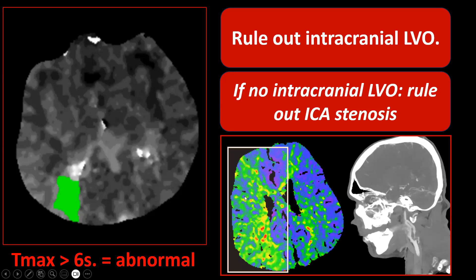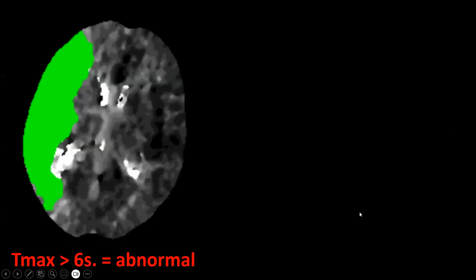The time-to-drain map of the same patient shows more extensive hemispheric changes in the right cerebral hemisphere — the time to drain has clearly increased. This patient has a high-grade stenosis of the origin of the right internal carotid artery, as we can see here.